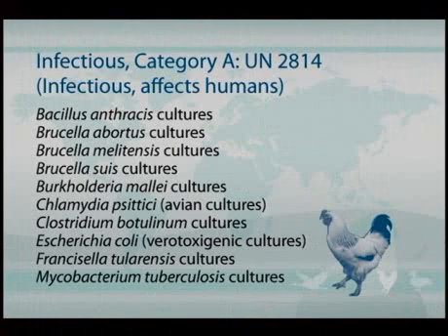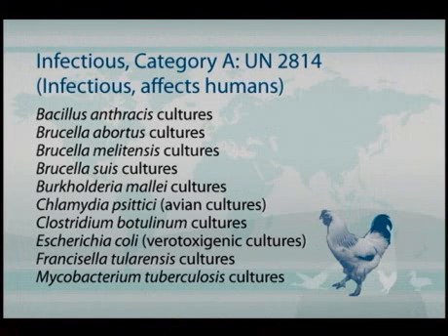These are some other examples of Category A, mostly of bacterial nature. So brucella, anthrax, chlamydia, etc. are some examples. All UN 2814.